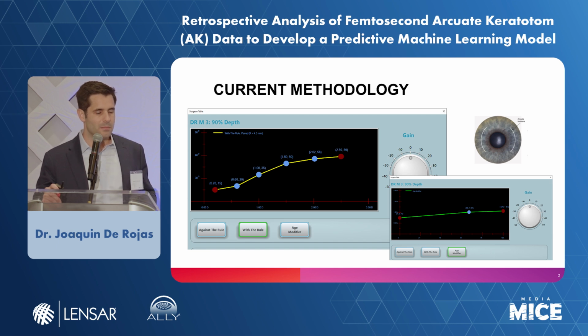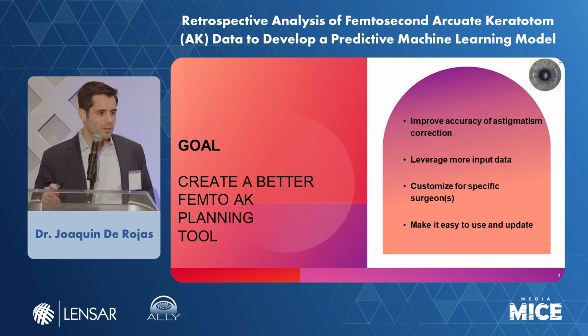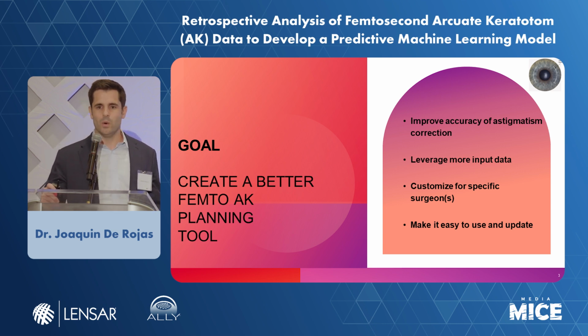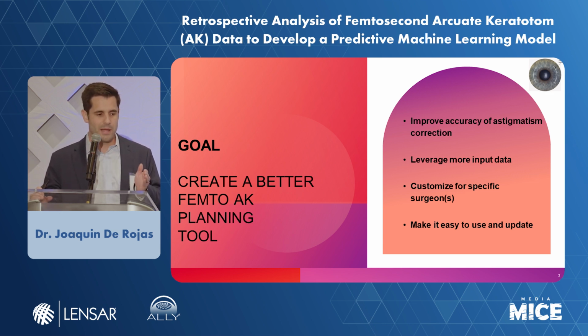And then we have some nomograms that use more regression analysis, a more mathematical way of doing it. But the goal here is how do we improve? Can we improve it even further? Can we leverage more input data? Maybe there are factors that we're not looking at that might be important. For example, what about white to white? Maybe in eyes that are wider, the arcuate placed at 9 millimeter diameter might have a very different effect than in very small eyes, right?